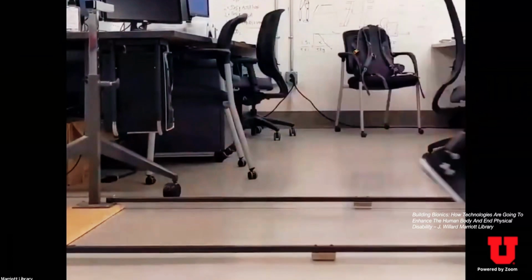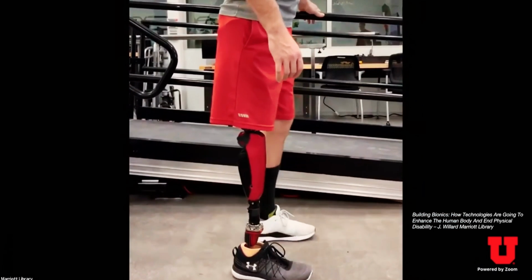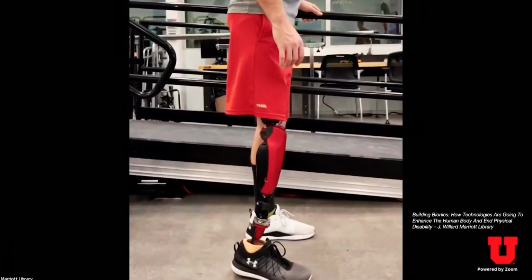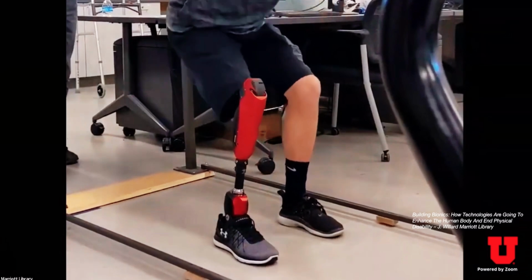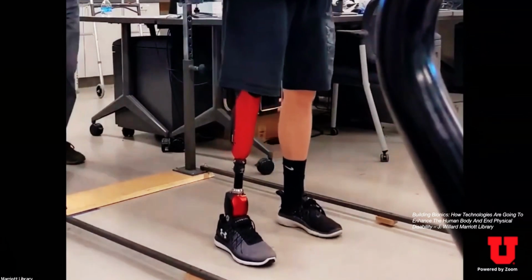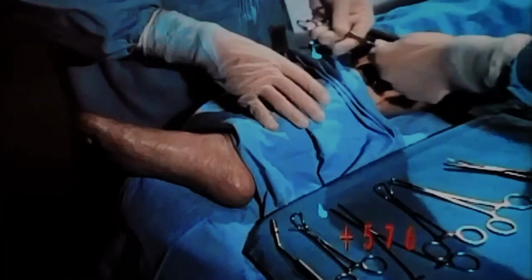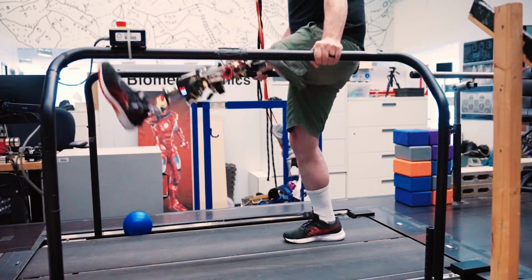The above-the-knee system features a titanium rod implanted into the residual femur bone, along with wires that gather information from electrodes located on the AMI muscles within the body. The idea behind this approach is to provide better load-bearing and mechanical control of the prosthesis than a socket-based option, while avoiding the possibility of skin infections. Signals from the AMI muscles are transmitted to a custom-built robotic controller, which calculates the torque necessary to move the bionic knee just the way the user intends.